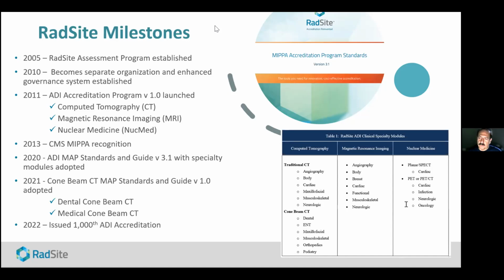One is what is referred to in this particular table as traditional CT, and the other utilizes a very different acquisition technique that takes multiple larger images, more analogous to taking single radiographs, but it takes them at multiple different angles and utilizes a different strategy to reconstruct those images. And ultimately, we can get images that look very analogous to traditional CT.